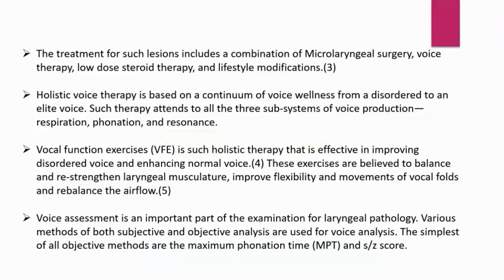Voice assessment is an important part of examination for laryngeal pathology. Various methods of both subjective and objective analysis are used. The simplest are the maximum phonation time, MPT, and the S by Z score.